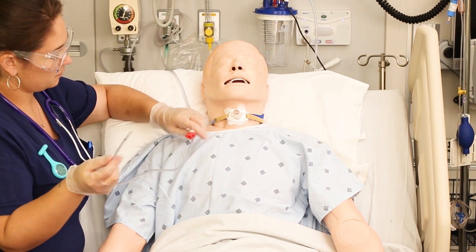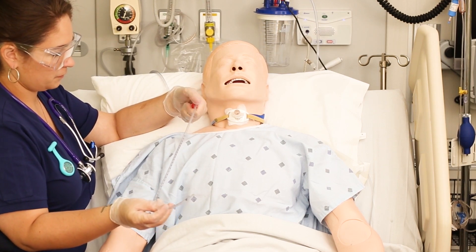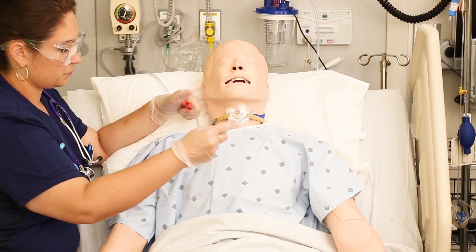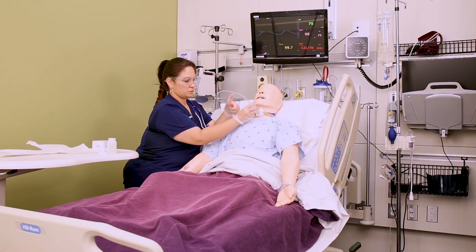At this point you are ready to suction. Use your non-dominant hand to move any oxygen mask and use the same hand to control the suction port with your thumb. Slowly insert the catheter into the tracheostomy until the patient coughs or you meet resistance, then apply intermittent suction while you twist the catheter on its way out.